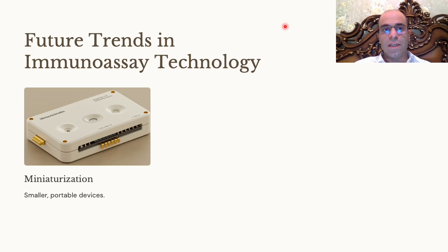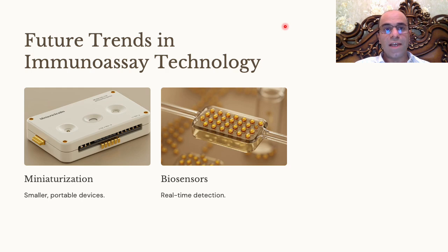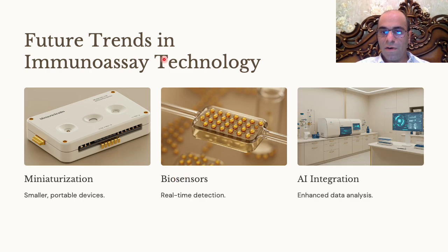These are really great. The second trend that may happen and will happen, we know that, are biosensors, electrochemical and optical biosensors enabling continuous analyte monitoring, surface plasmon resonance SPR technology, providing label-free real-time detection, and also nanomaterial enhanced biosensors improving sensitivity to femtomolar concentrations. That's great. And the last one is, as we see here, AI integration.